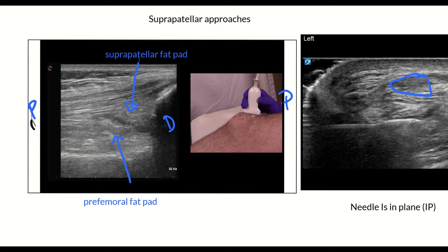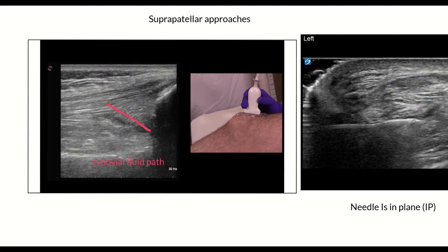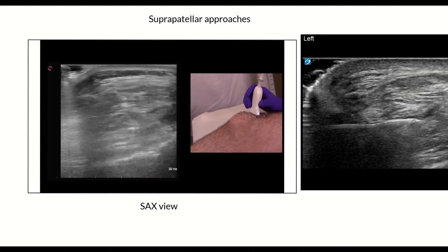The needle is coming in in long axis, in this particular case from medial to lateral. If you have a knee that has a small amount of synovial fluid, then this is definitely the easiest way to get a needle into the joint. I'd also like to point out the path of the synovial fluid — if your transducer is more proximal on the thigh, the synovial fluid is going to be more superficial, but as you scan more distally it drops down. This can be a distinguishing feature when looking in short axis to the quadriceps.